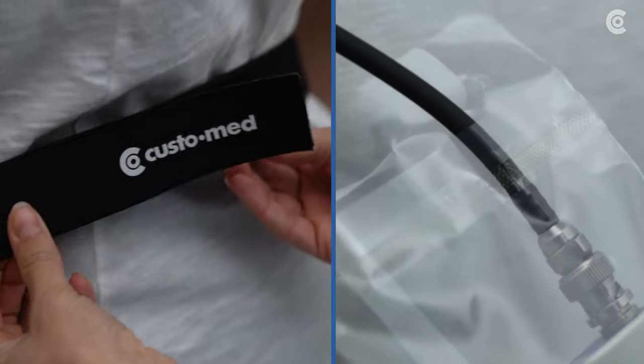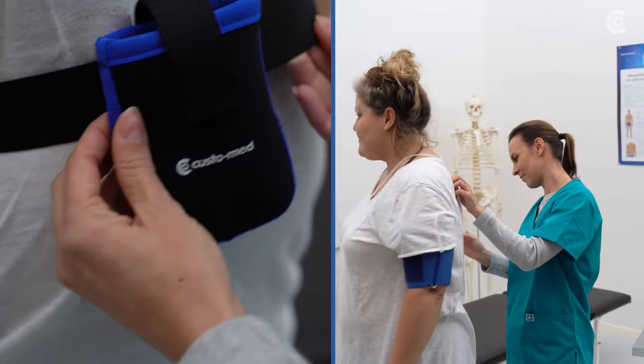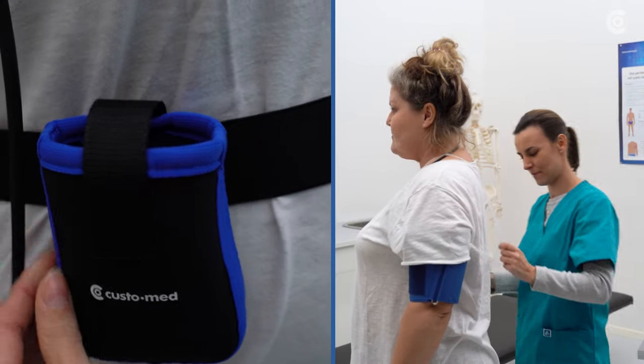Place the recorder over the t-shirt or undershirt and advise the patient not to remove the Screen 300 during the entire examination.